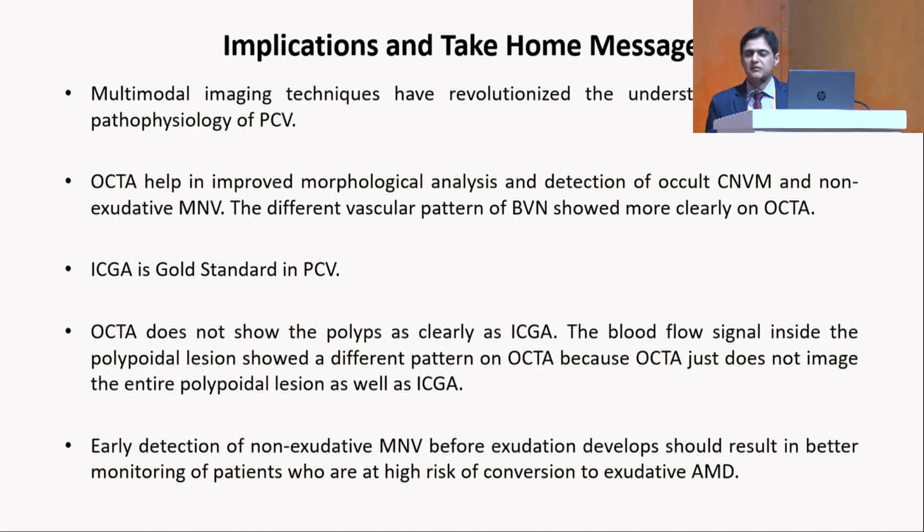So I think multimodal imaging has really revolutionized our understanding of AMD as well as PCV, and it shows a very good morphological analysis of occult CNVMs, and as I said, of type 3 CNVMs, and we can even differentiate the treatment. But for PCV, ICG is still the gold standard, and as I said, for non-exudative MNV, there is no need to treat before any exudation develops, as it even has a protective role.